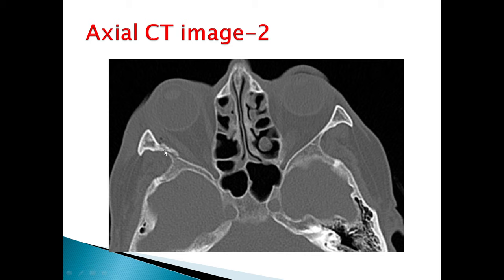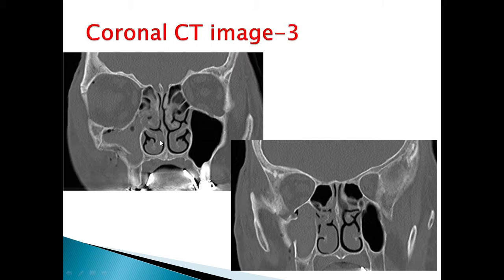The second axial image shows a minimally displaced fracture of the right lateral orbital wall with minimal air loculi in the right extraconal space. This is the lateral rectus muscle, and this is the extraconal space with some air loculi.